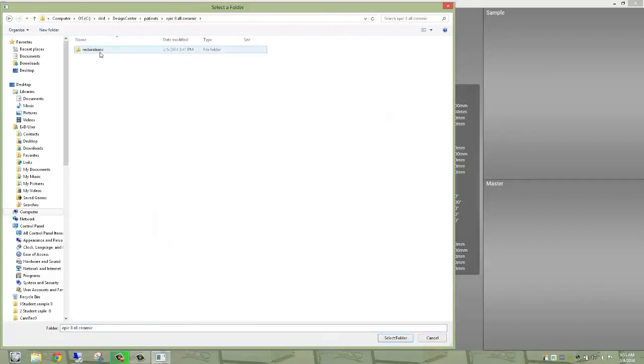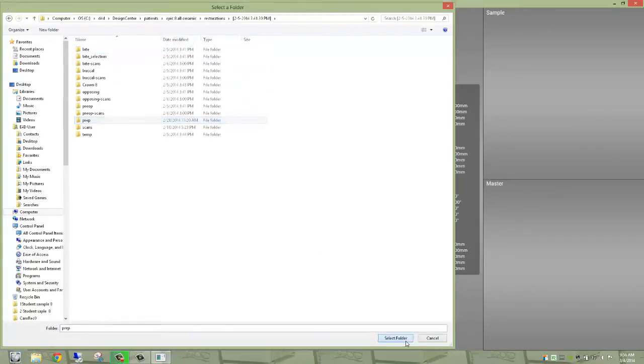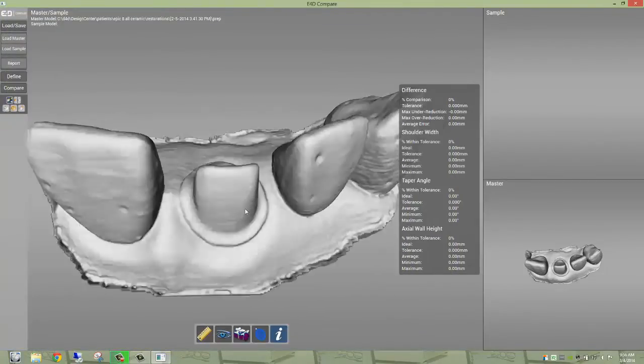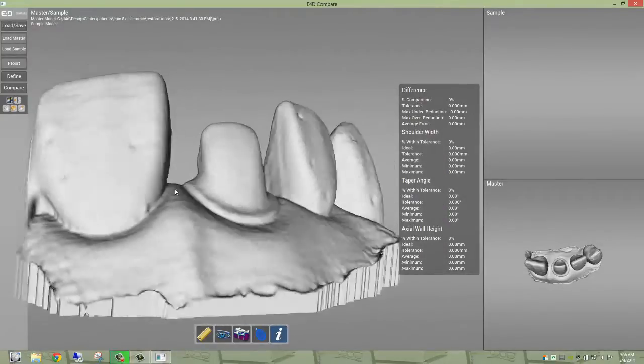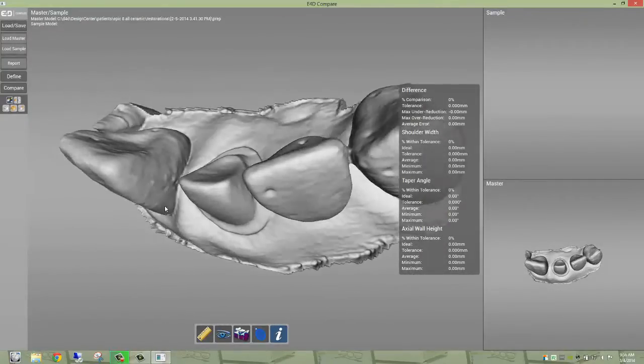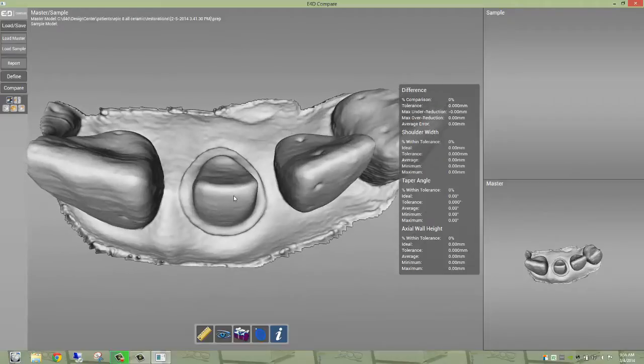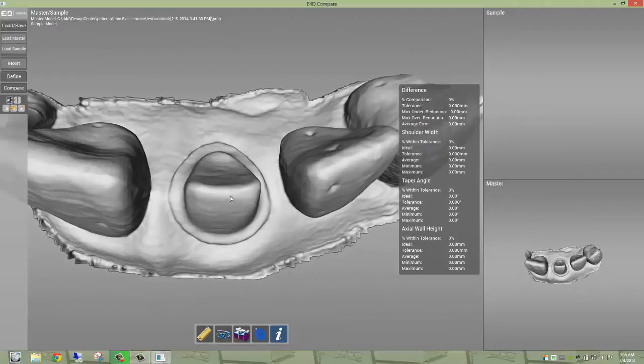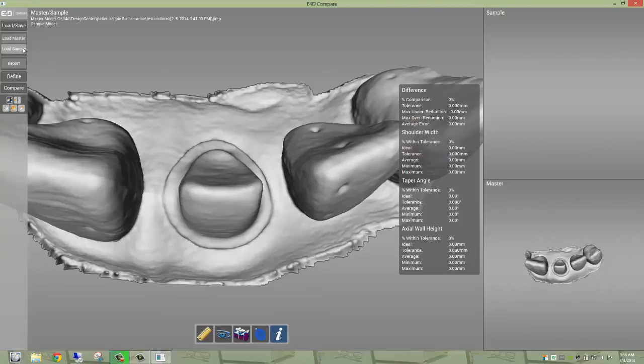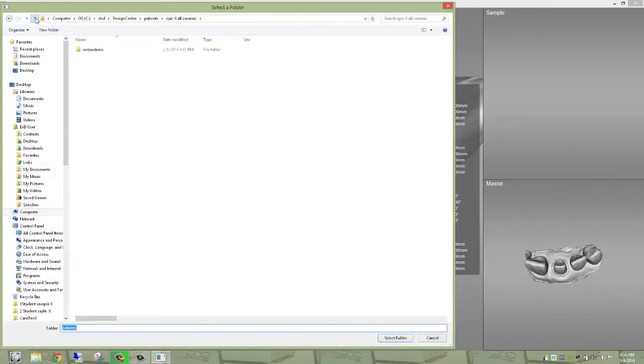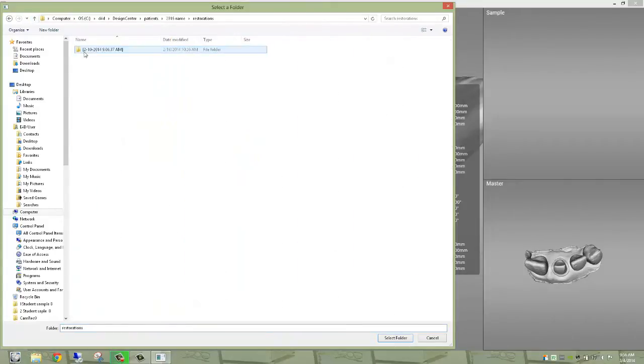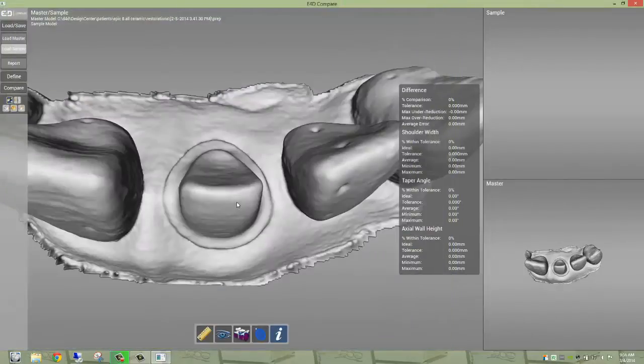And we're going to open that folder, restorations, it timestamps it, and we're going to find the prep folder. And here is the department approved anterior all ceramic preparation master that is reduced to the proper specifications that we decided on as an institution. And then you're going to load the student preparation that we just scanned in, and it's also in that same prep folder. And we call it 2016 name, and we're going to find that prep folder right there, and we're going to select that.